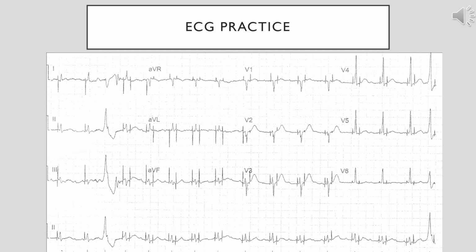And it's almost in a 2-to-1 fashion where we see a spike with the first one, and then for some reason the pacemaker is sending out a spike almost immediately afterward. This may be where the pacer isn't sensing that initial QRS complex, but this can be very problematic for someone that has this pacer if they are not capturing complexes.